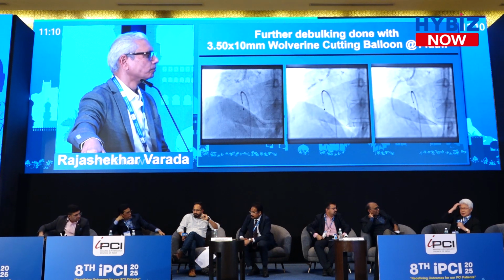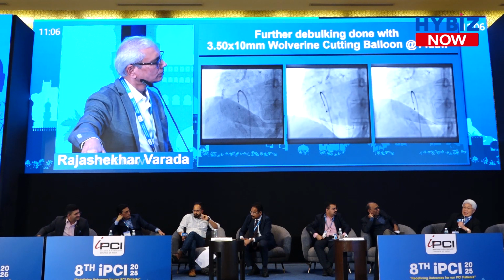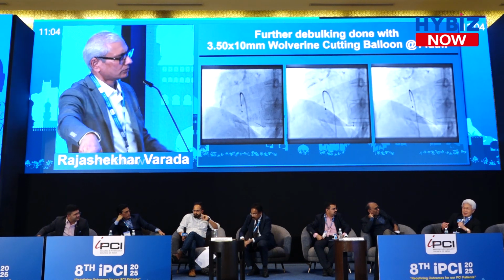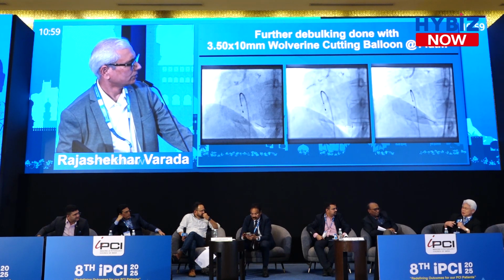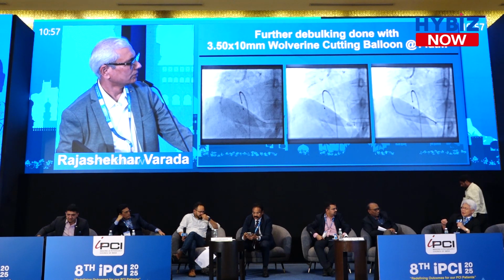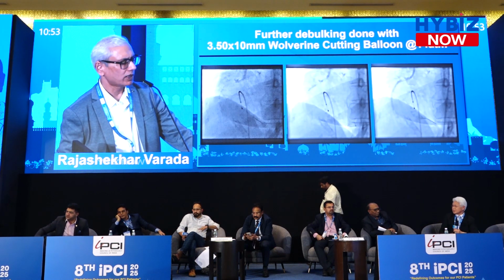So in this case it might be very difficult, but after ablation of the calcium, you can use high pressure ballooning to make a crack. And if it is enough, you can put a stent. So I totally agree, sir.